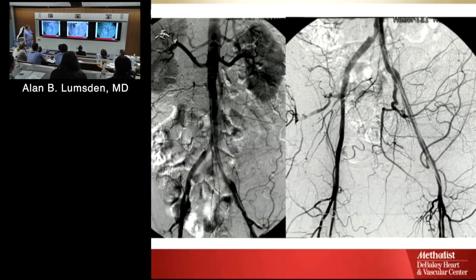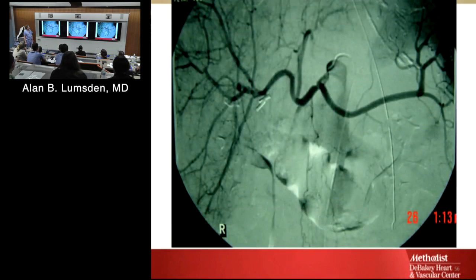Visceral circulation, we've already looked at this. Okay, so here a catheter has been placed in the origin of the celiac artery. Okay, so next up, what's that? Usually it's a lot more. One of the ways you recognize the splenic artery is it kind of goes up and down like this. You don't really see that very well in this particular situation. What is that? Common hepatic. When does it change to the hepatic? When the gastroduodenal, very good. And then you've got the true hepatic, and it divides into what? Right and left hepatics. We'll give you that one.